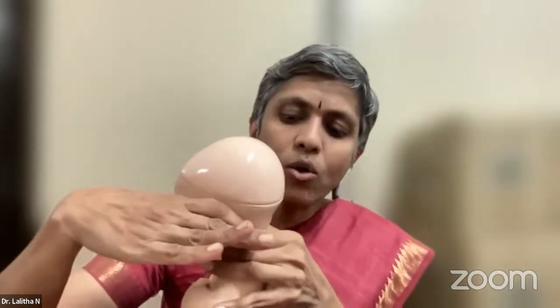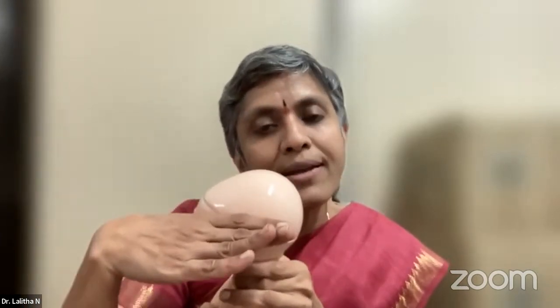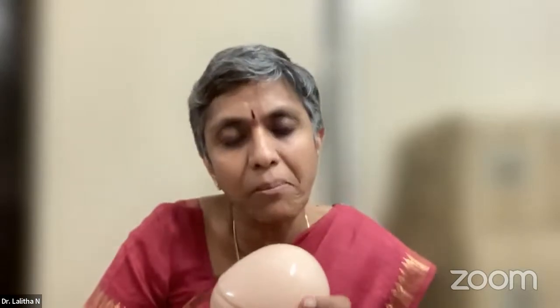The question in the question answer box: why BPD in a transventricular plane? Yeah, I wanted to tell it that time itself. When we take a BPD, you should be very sure that you're not including the posterior fossa. When you're coming down to get the arrow sign, unconsciously you will be including a part of the cerebellum, which we don't want. So many times in our eagerness to measure the thalamus and the V sign, we would be looking at the cerebellum. To avoid that, even ISUOG recommends measuring in the transventricular plane, where there's no role of a posterior fossa. So it's the same.